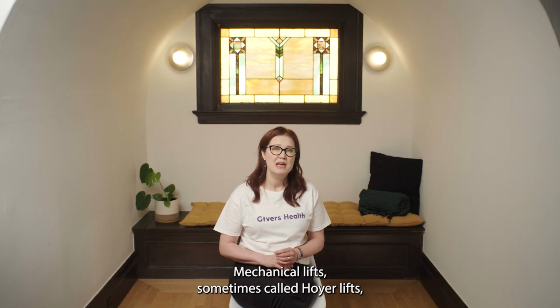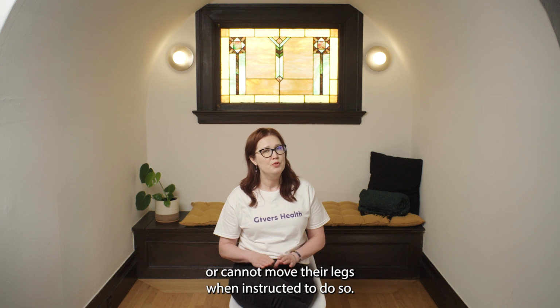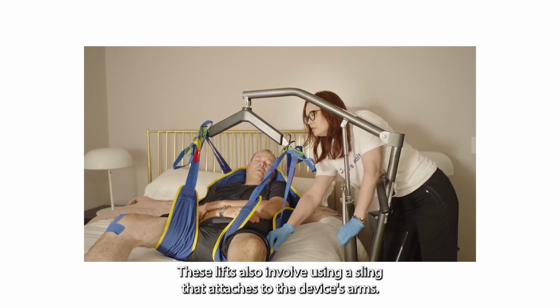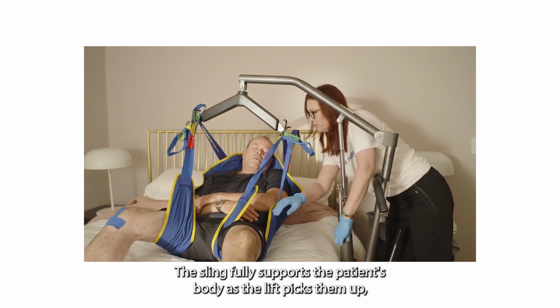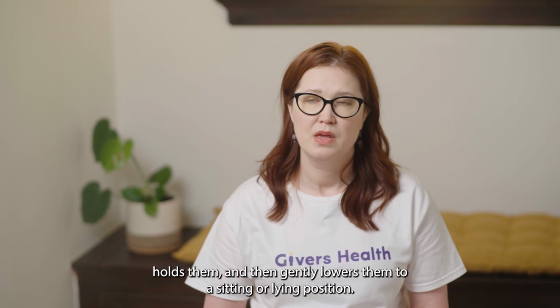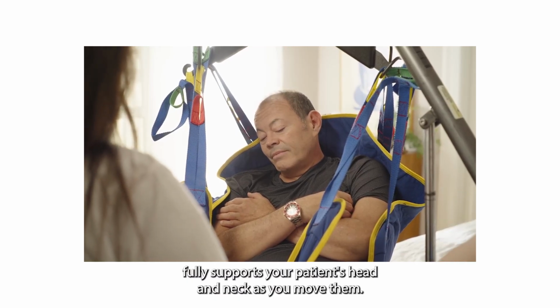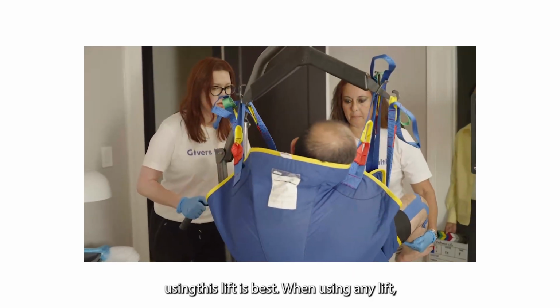Mechanical lifts, sometimes called Hoyer lifts, are used for patients who cannot bear any weight on their legs and feet, or cannot move their legs when instructed to do so. These lifts also involve using a sling that attaches to the device's arms. The sling fully supports the patient's body as the lift picks them up, holds them, and then gently lowers them to a sitting or lying position. Always make sure the sling fully supports your patient's head and neck as you move them. Having a second person to assist you as you transfer your patient using this lift is best.